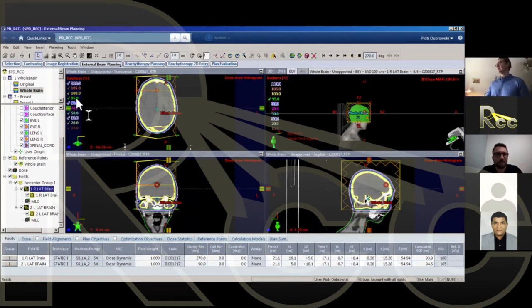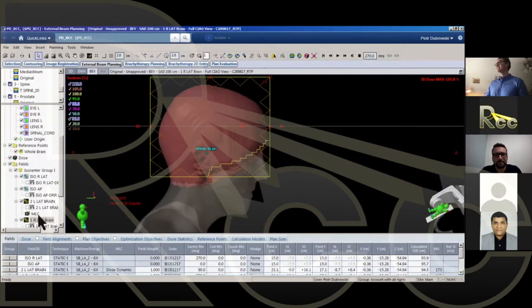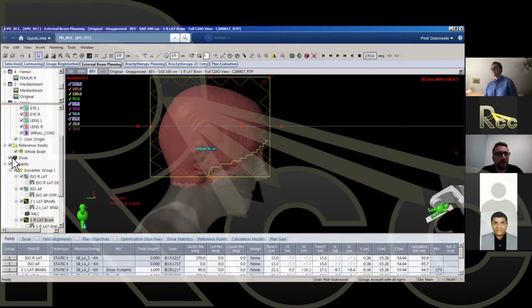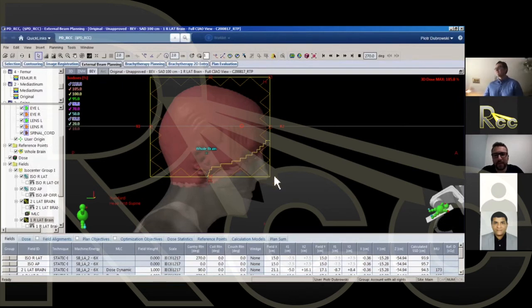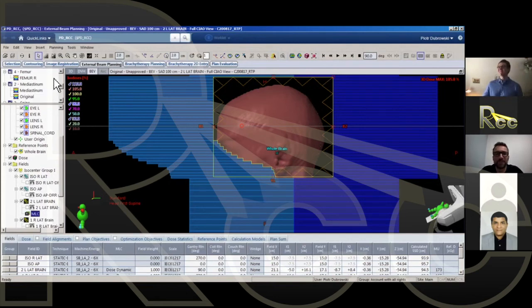Showing the corrected plan: the original treated plan has blocks that shield the lens and face, whereas the error plan was simply missing those blocks. You can see the green 90% isodose line covering the eyes and face when the shields are absent. The corrected version clearly shows the blocks protecting the lens. The planner or physicist simply forgot to include them in the error version.